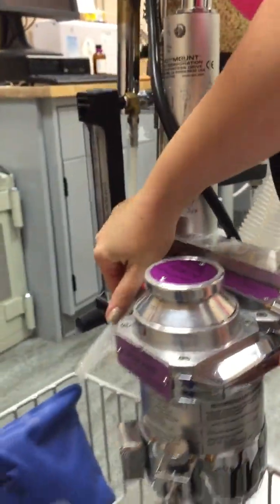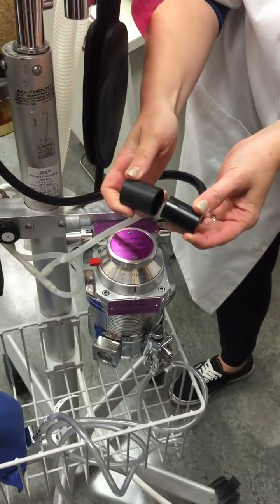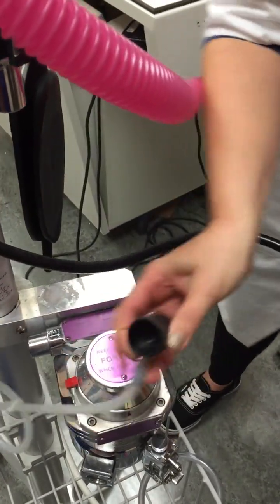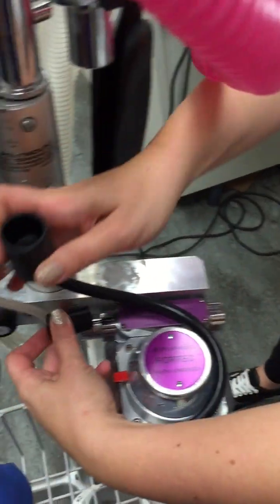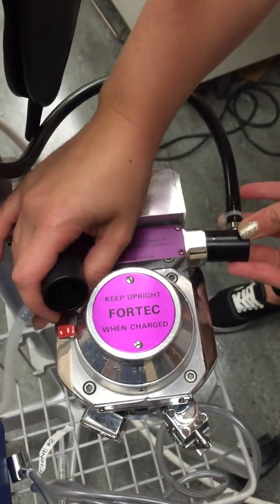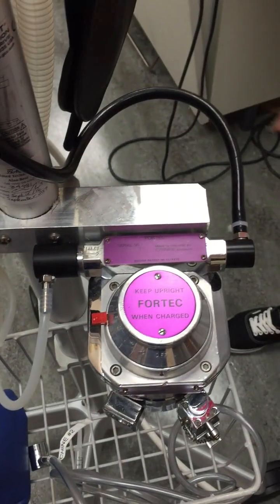Now, these adapters actually do come off, and there is a safety mechanism with them. They are different sizes, so you cannot put the inlet adapter onto the outlet side. It just will not fit, and vice versa. The outlet one does not fit on the inlet, so you cannot put the incorrect adapter on the vaporizer. And you just push them in with a little bit of a snug fit, just like that.